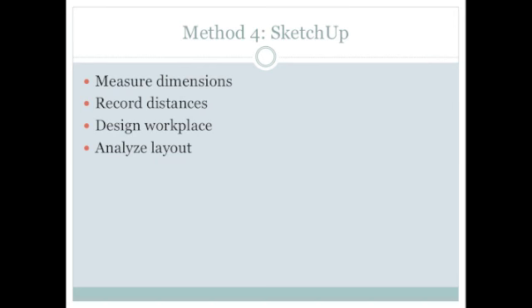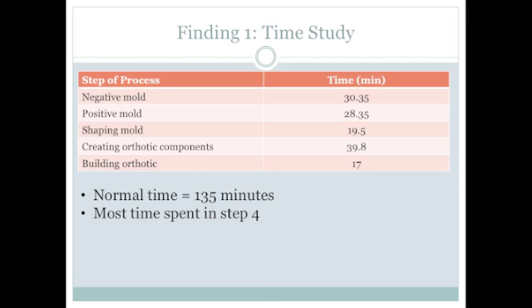Our final method was to create the workstation layout in SketchUp. While touring the facility, we measured the dimensions of the workbench, the distance from the workbench to the oven, and the dimensions of the entire workspace. By using SketchUp to design the main workstation and workplace, we were able to analyze the traveled distances. Now we will discuss our overall findings.